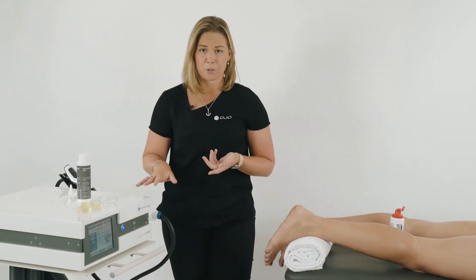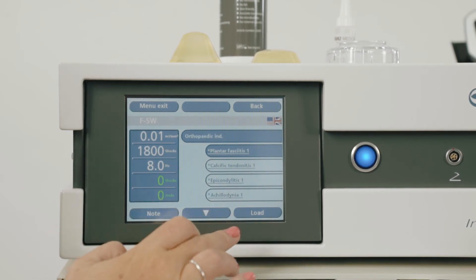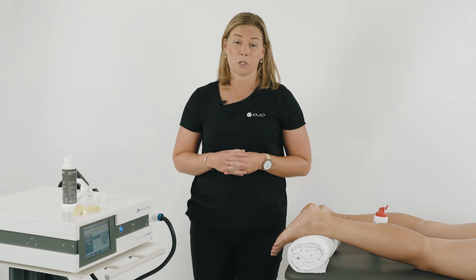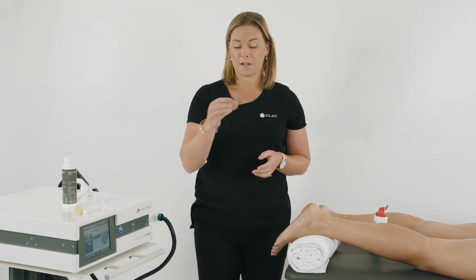To use the focus machine, we're going to load the configuration or program. Find the orthopedic conditions and select plantar fasciitis. Load this program and touch the screen to engage the parameters. Depending on the tissue depth and where you want to deliver the energy, you'll apply the standoff. We've got two standoffs — standoff one and two. In this case, we're going to use standoff one.